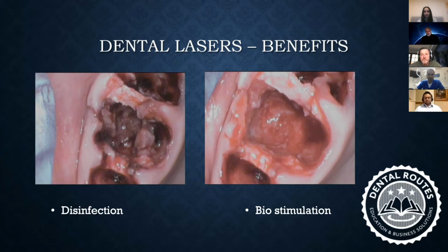And that is how you have wonderful control in dealing with the hard tissue, because you don't actually come in contact with the hard tissue. Okay, thank you.